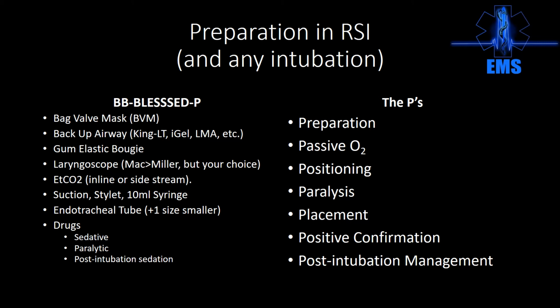Our other friend in EMS for airway management is the bougie. I still call it the gum elastic bougie. I can't get it out of my head. It's no longer made out of gum elastic. It's made out of plastic. But the bougie is a great tool when properly deployed. It allows you to control a very difficult or invasive airway with a much smaller tube rather than trying to negotiate the big ET tube.